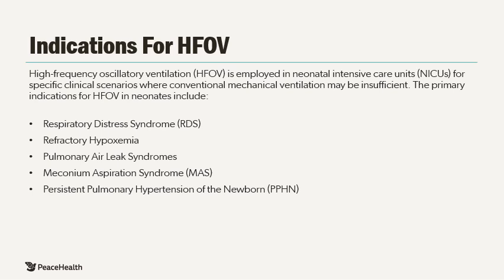High-frequency oscillatory ventilation is employed in neonatal intensive care units for specific clinical scenarios where conventional mechanical ventilation may be insufficient. The primary indications for high-frequency ventilation in neonates include respiratory distress syndrome, particularly in preterm infants. High-frequency ventilation can be utilized to manage severe RDS, aiming to improve oxygenation and reduce ventilator-induced lung injury. When conventional ventilation fails to maintain adequate oxygenation, high-frequency oscillatory ventilation serves as a rescue therapy to enhance gas exchange.